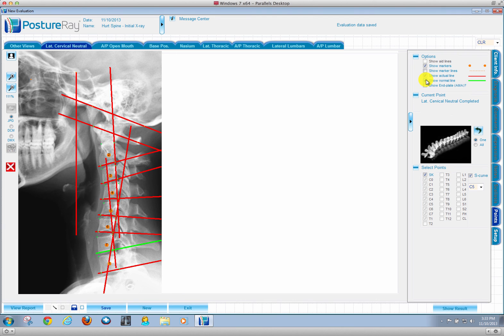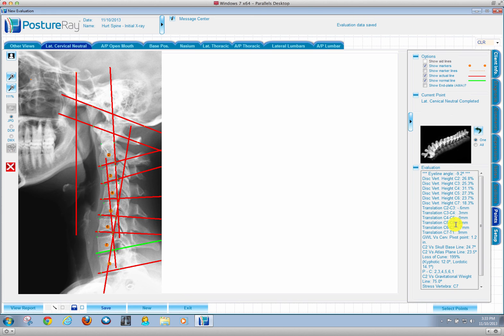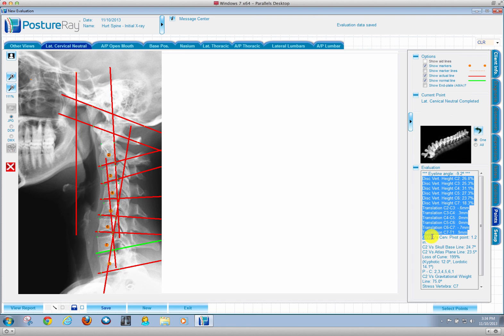Just to show you, we have the total technique analysis of their cervical spine. All the values have already been done, all the disc height values right here, the translational distances, gravitational weight line, everything.